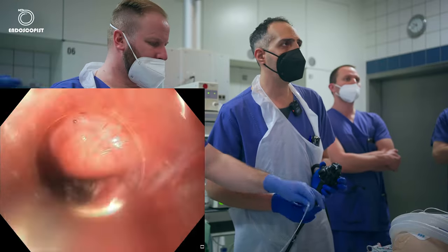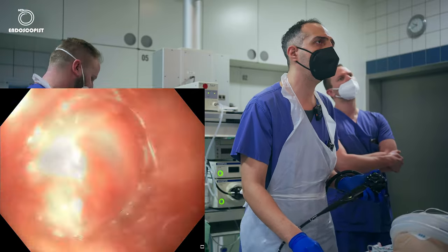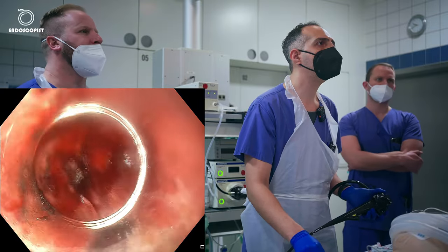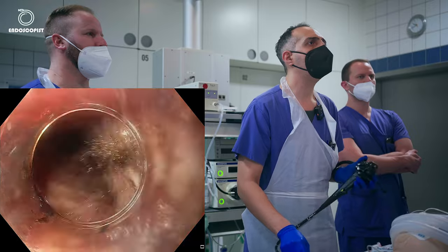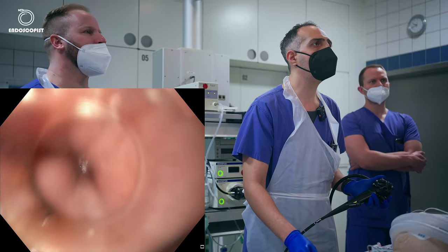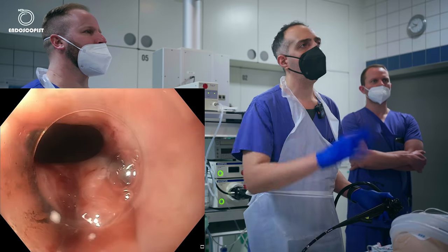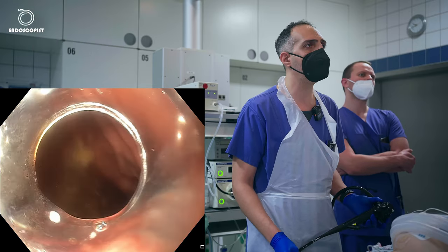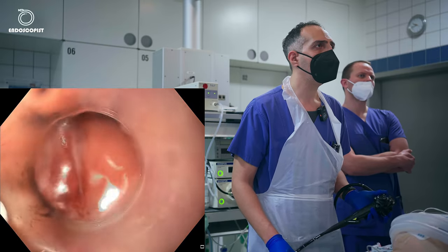So I will check the lumen from outside to see that everything is fine. I'll do some suction first, make the tunnel clean. That was our bleeder, which we did with coagrasper. So I will go outside now. Some suction, and the cardia should be open for us. Yes, very nice. So if you see a lumen, I'm not doing any pressure on this area. I'm just pushing the scope very gently, and it's quite open, which for me is also a second confirmation that it's fine.